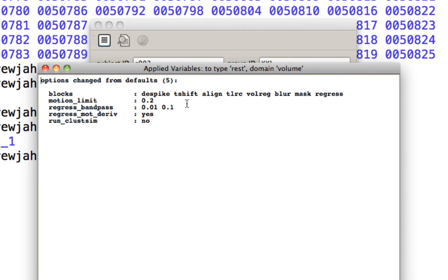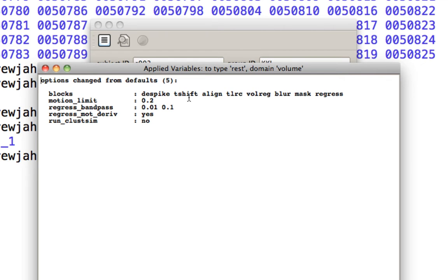Notice it just shows you what's been changed. So we're doing a specific set of preprocessing blocks, specifically despike, time-shifting, alignment, which is slightly different from what we do in a traditional, typical task-based analysis.